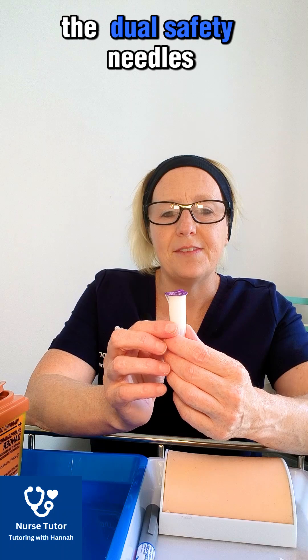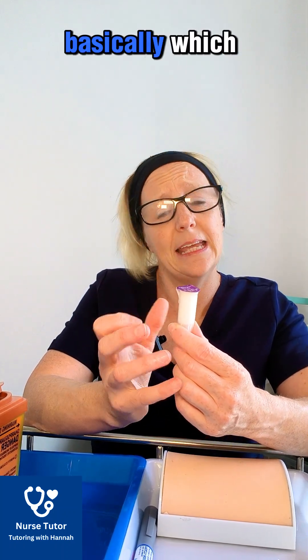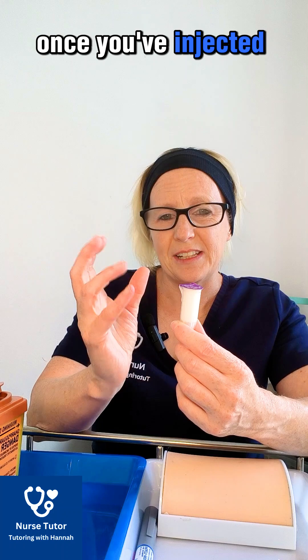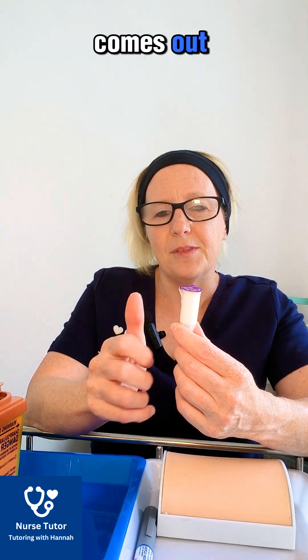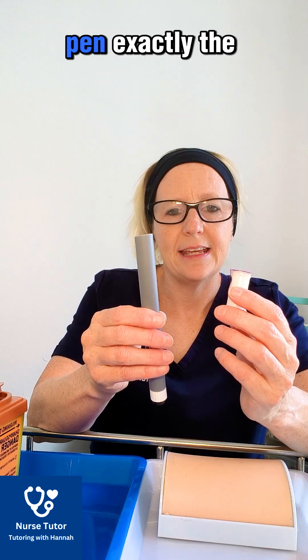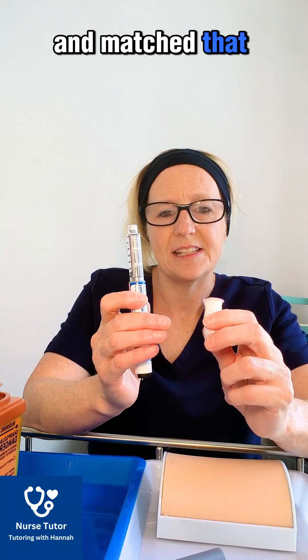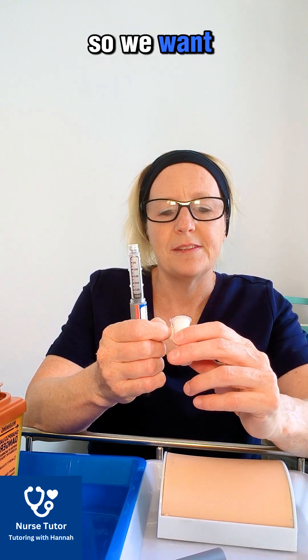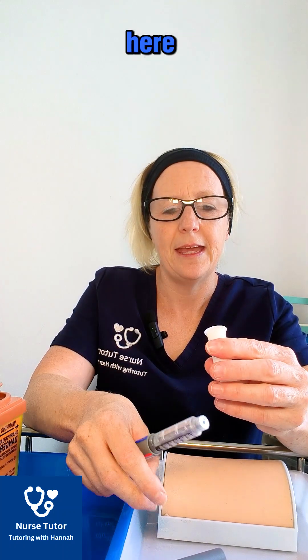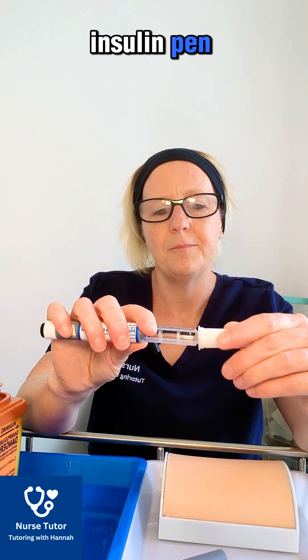The dual safety needles have a retractable cap on them which, once you've injected, comes out to reduce the risk of sharp injuries. We attach it to the insulin pen exactly the same way. Remember we would have also checked our insulin and the expiry date and matched that against our prescription. Take off the paper cap and it screws on to the insulin pen exactly the same.